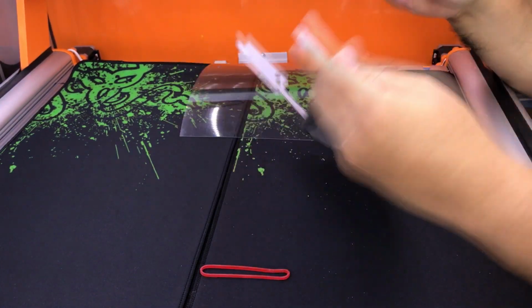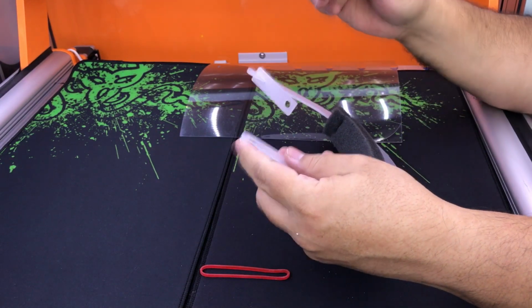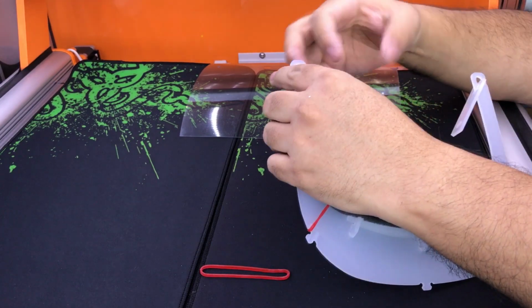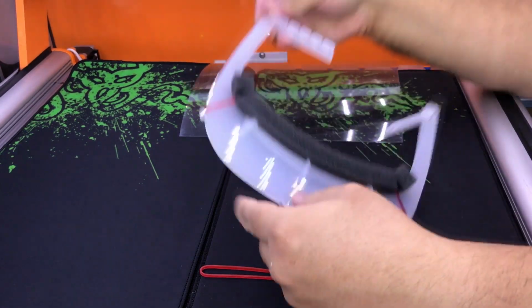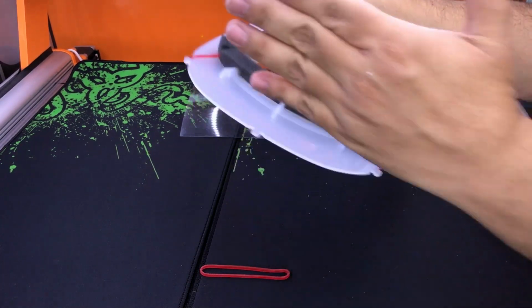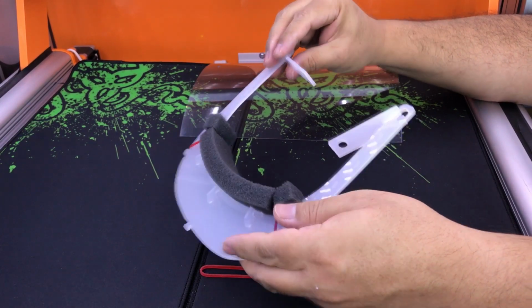Preferably, this part needs to be up. So if you're going to put the mask like this, because everything is symmetrical, it can be used like this or like this. So if you're going to put the mask like this, this has to be up. It's better.